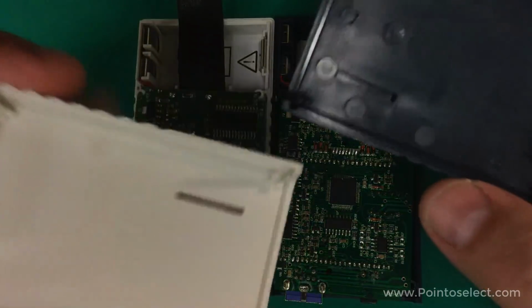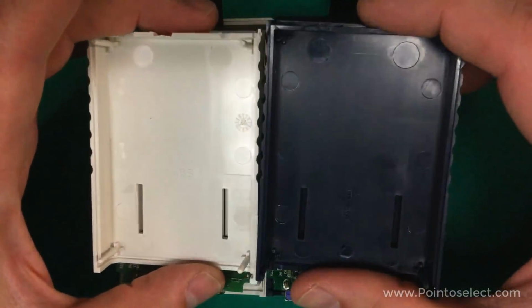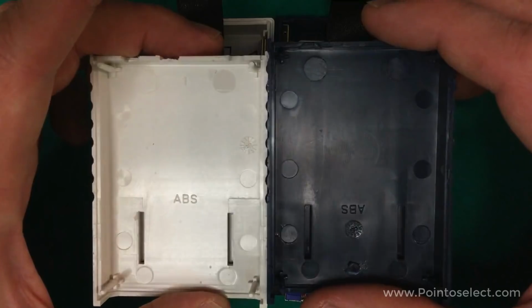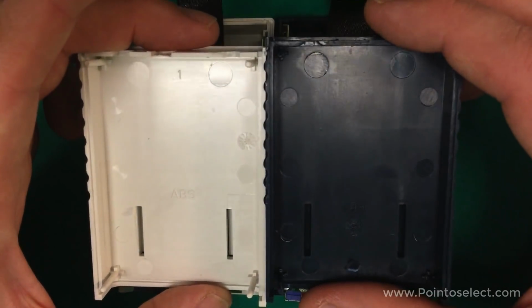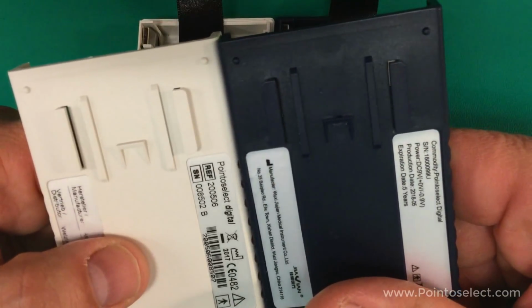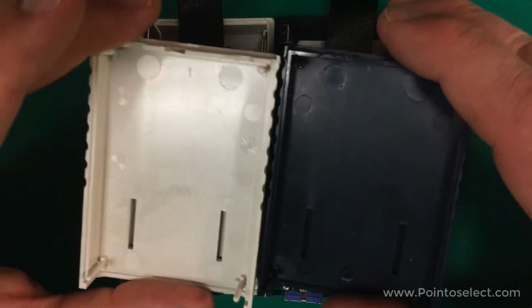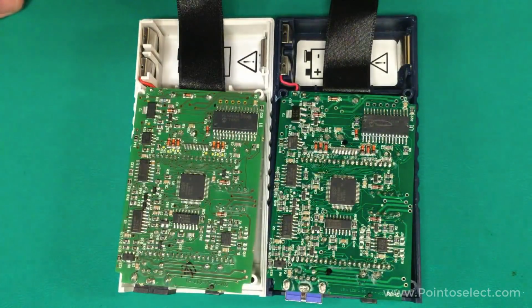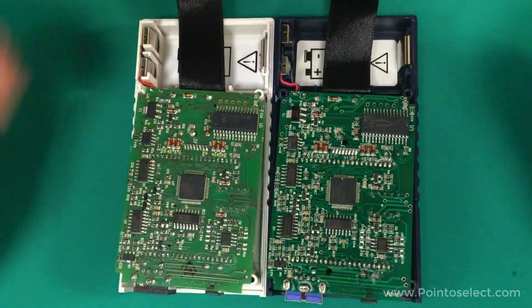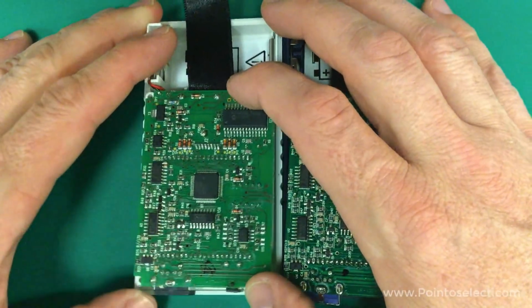Let's take a look at these cases here, made out of ABS plastic. We've got the same ejector pin marks, looks like the same mold. As far as I can tell, the way the mold's designed and everything seems to be the same in every respect. And so there's a good chance these are made on the same mold, and simply use blue plastic for one of them, white plastic for the other. That's common in manufacturing. Once you have a mold, you can make any color you want, just whatever color plastic you choose to mold it in.